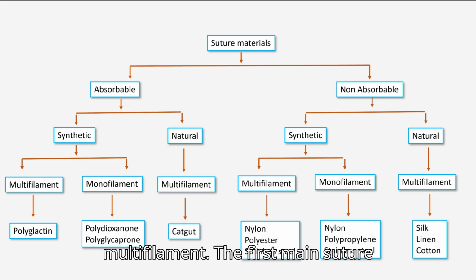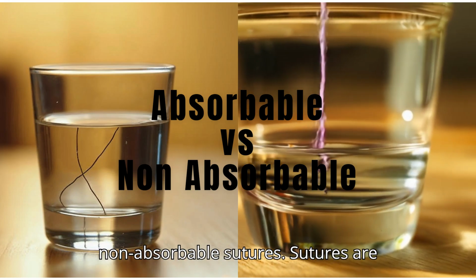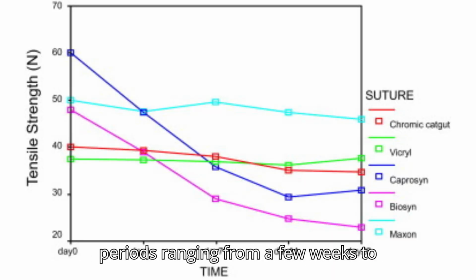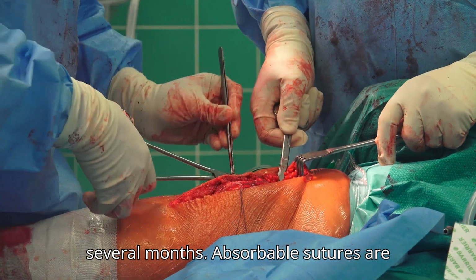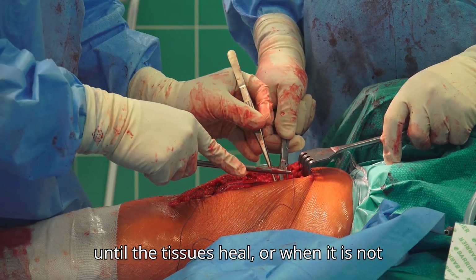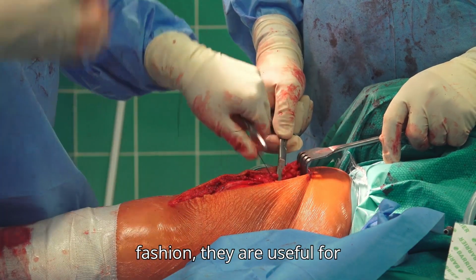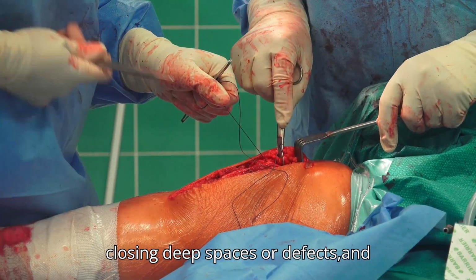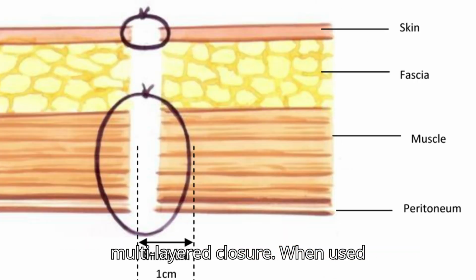The first main suture category is absorbable versus non-absorbable sutures. Sutures are considered absorbable if they lose most of their tensile strength over variable periods ranging from a few weeks to several months. Absorbable sutures are often employed for deep temporary closure until the tissues heal, or when it is not easy to remove them otherwise. In this fashion, they are useful for approximating edges of tissue layers, closing deep spaces or defects, and facilitating wound healing as part of a multi-layered closure.